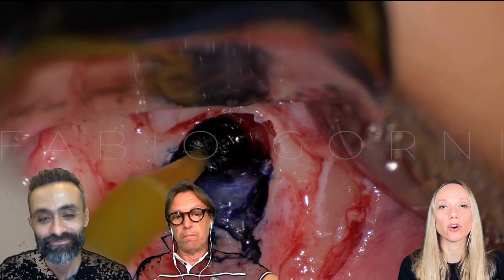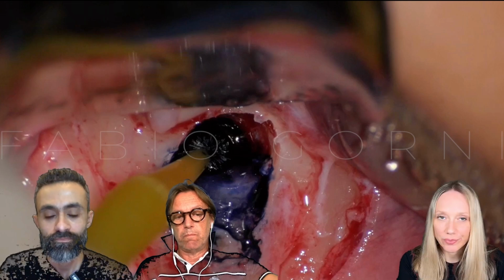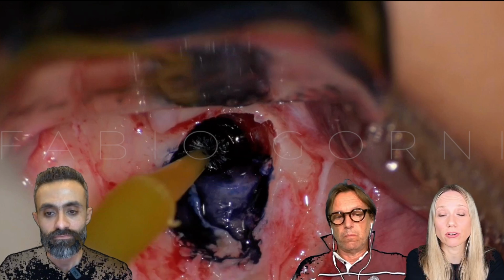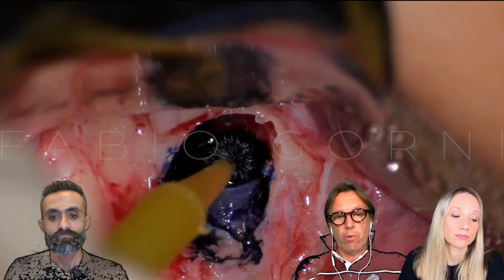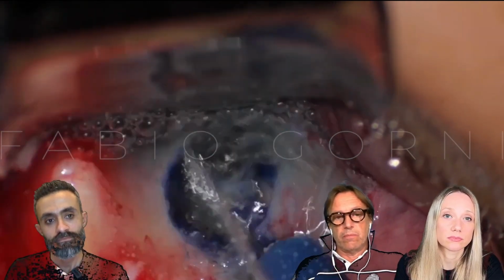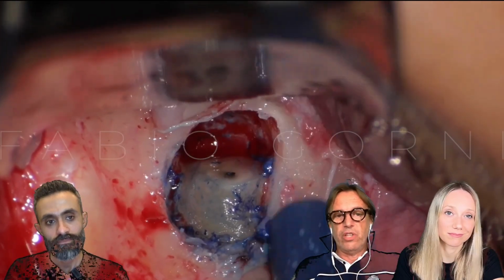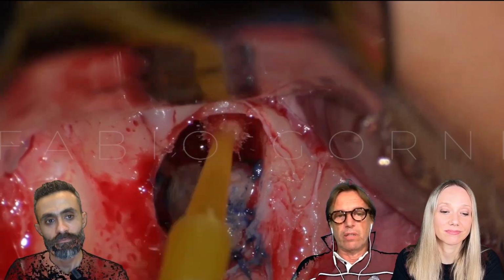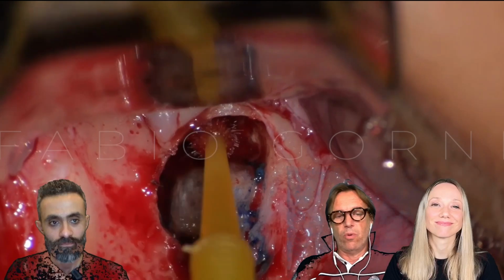And another thing, we know that most of the time lesions are there because there is some missed anatomy. So how do you identify the anatomy of the apical third of the tooth once you have resected the root? Using methylene blue, for example, can help us a lot. Then we can clean everything with some saline, and the vision has improved a lot. Now I can see two different portals of exit in the apex. It's typical in this kind of tooth.